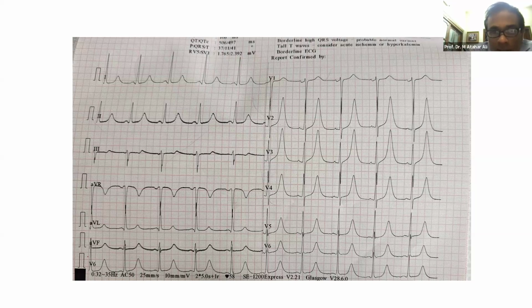As the patient is unconscious and on the ventilator, and the troponin is raised, can it be due to some kind of ischemia? Because LVH-related T waves should not be like this. There should be other criteria as well as the T wave, that is, R wave changes. In the absence of R wave changes and ST-T changes, only the T wave cannot satisfy the criteria for LVH.